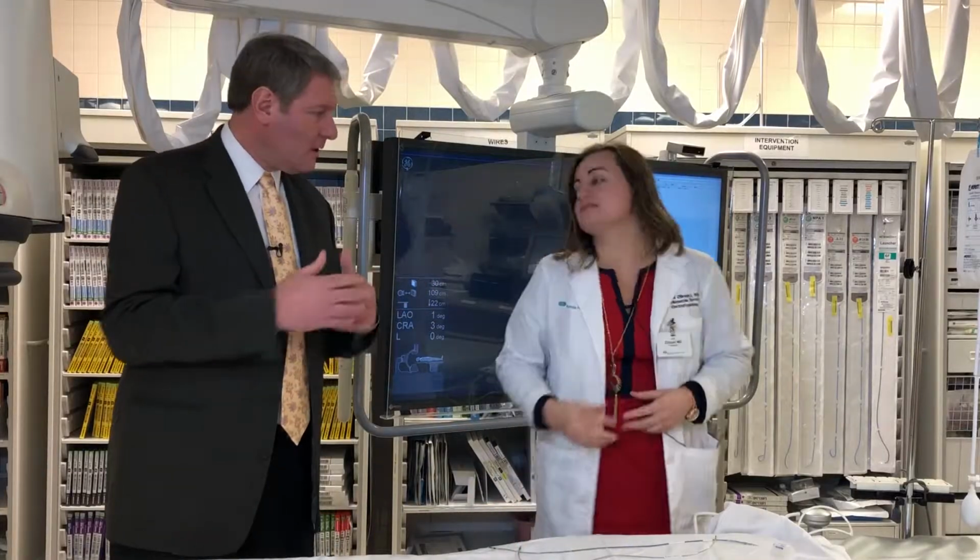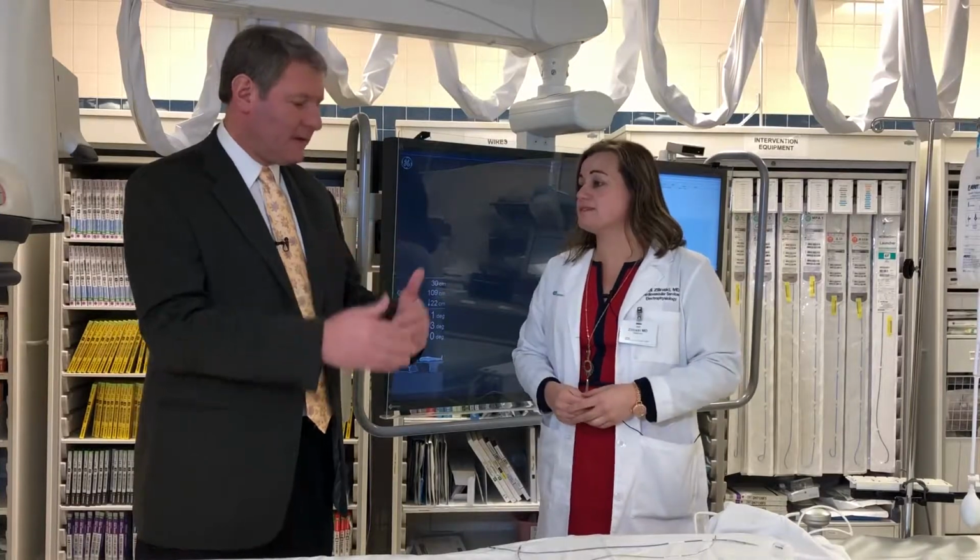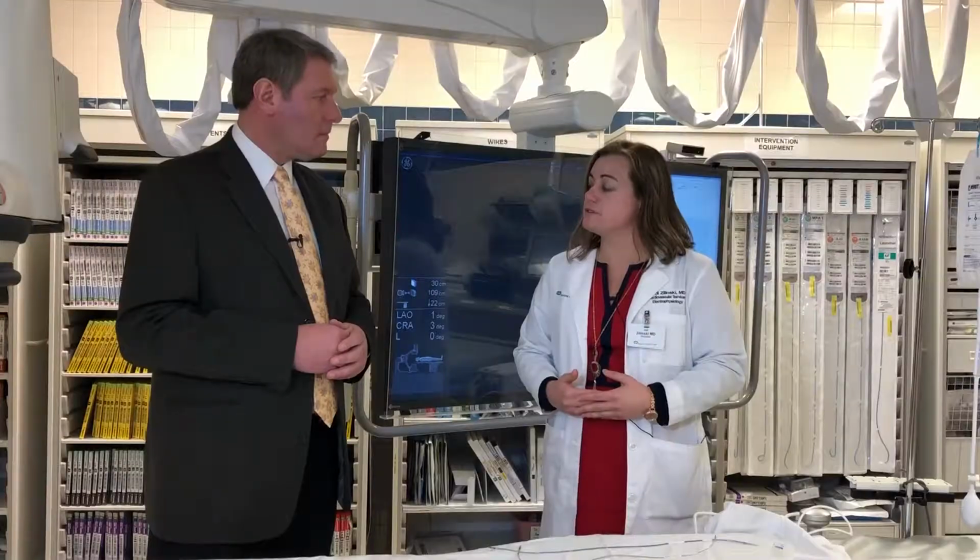Are the procedures long, painful, or what can a patient expect if you have to have one of these procedures? On average for a traditional pacemaker or defibrillator procedure, it's about 1 to 2 hours to have it put in, usually on the shorter side of that. They tend to be done under local anesthesia, so there's just numbing medicine and then a little bit of sedation to make you calm and relaxed and hopefully sleep through most of the procedure. So minor discomfort, kind of like a pulled muscle after the procedure. So it sounds like an outpatient procedure? It is. You spend one night in the hospital after they're put in to help monitor and make sure everything's going well, and then go home the next day.